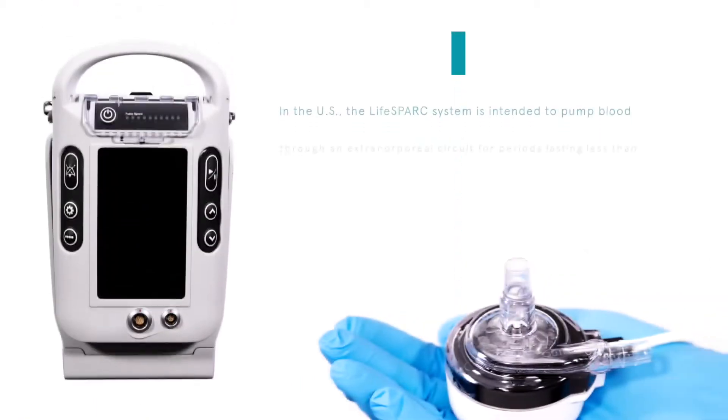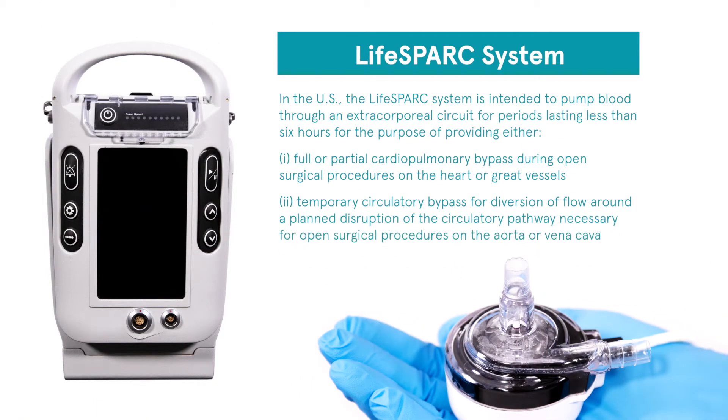In the U.S., the LifeSpark system is intended to pump blood through an extracorporeal circuit for periods lasting less than 6 hours for the purpose of providing either: 1. Full or partial cardiopulmonary bypass — for example, a circuit that includes an oxygenator during open surgical procedures on the heart or great vessels — or 2. Temporary circulatory bypass for diversion of flow around a planned disruption of the circulatory pathway necessary for open surgical procedures on the aorta or vena cava.